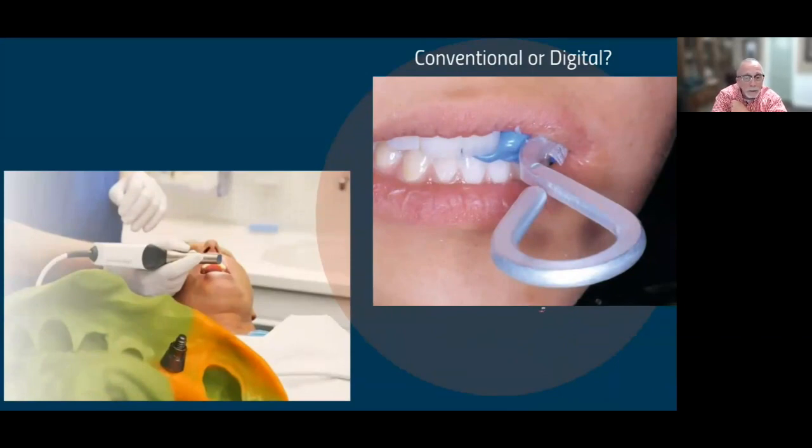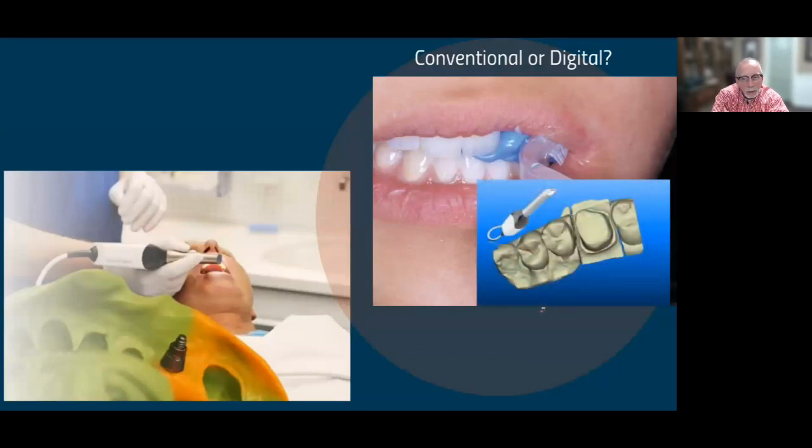And for years and years and years, I always used impressions. And one of my main jobs was to go out and help folks take better impressions for implants. Because if that's not done right, we know we have an issue at seating time. And I'm surprised over the years that as scanners started to show up in more and more offices, even when offices had scanners, they still seemed to gravitate over to polyethers or polyvinyls to take the implant impressions. That's changing quickly. I think now that the adoption rate has really skyrocketed with intraoral scanners in dental offices, that's really changed because they've proven themselves with hard tissue. We know that we can do crown and bridge successfully with an intraoral scanner and do it easily and quickly.